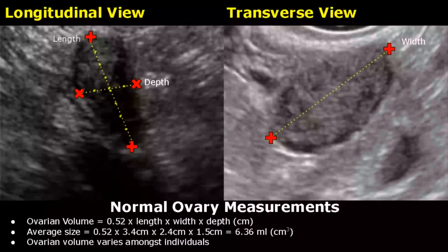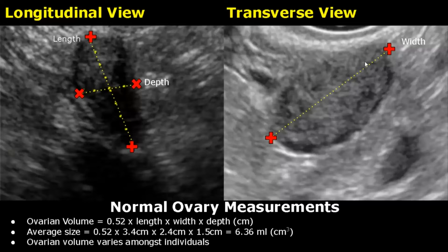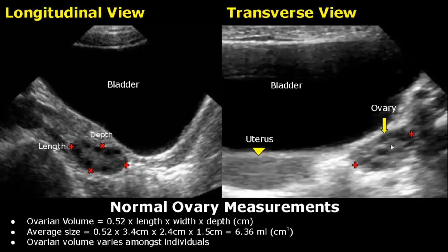Here are more transvaginal images showing measurements of the ovary — length, depth, and width in transverse view. These images are transabdominal with caliper placements for length, depth, and width of the ovary.